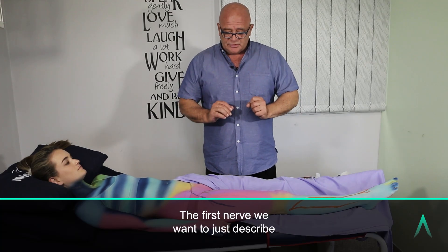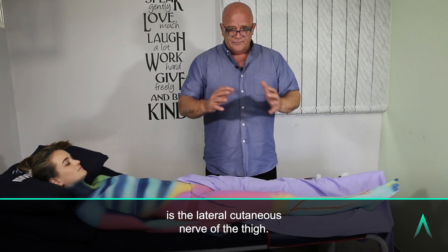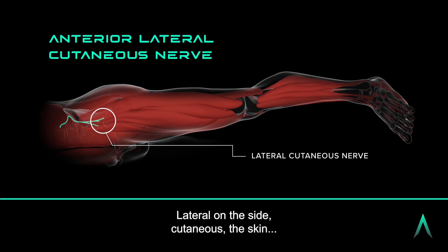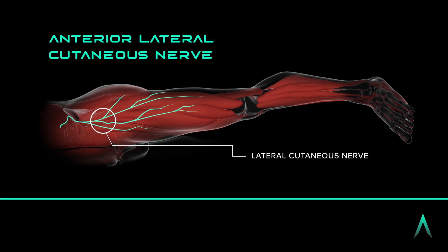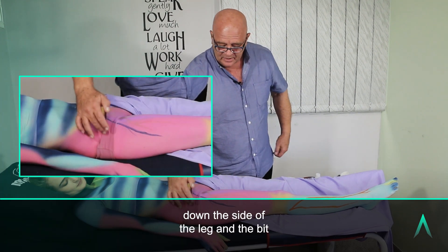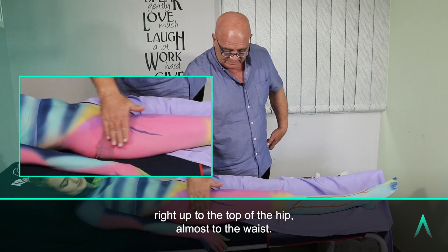The first nerve we want to describe is the lateral cutaneous nerve of the thigh. It's exactly what it says: lateral, on the side; cutaneous, the skin; nerve of the thigh. It's the nerve that supplies the area down the side of the leg and right up to the top of the hip, almost to the waist.